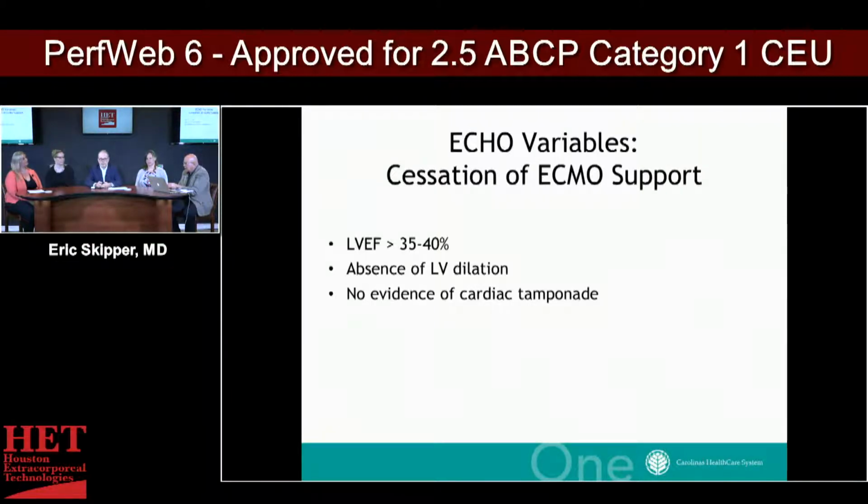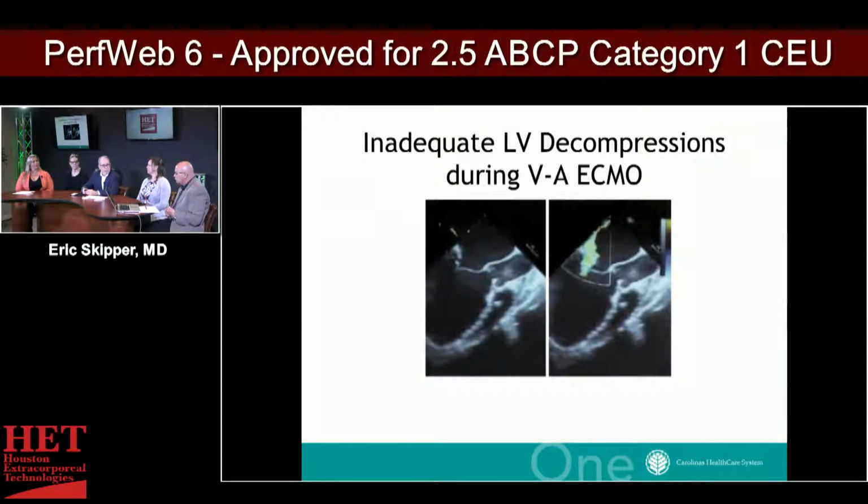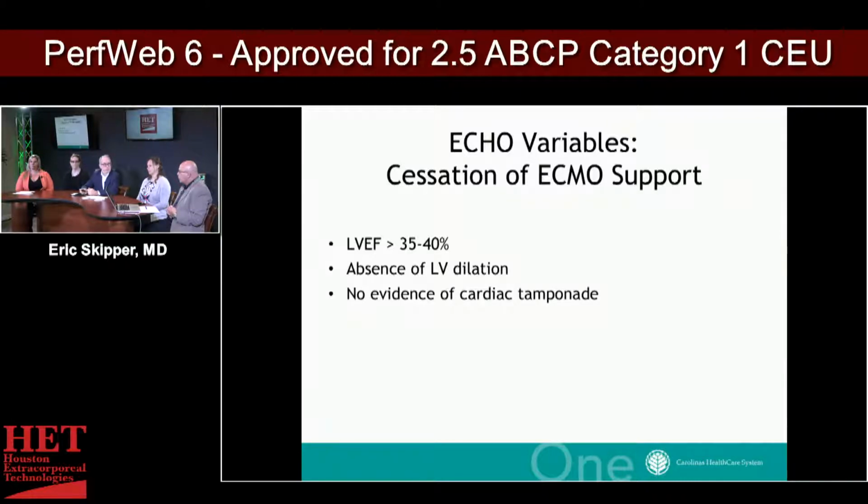So would you put an Impella in that? So I would do one of two things. If they were centrally cannulated, I would put a LV vent in. If I would consider an Impella, I would also consider a tandem type catheter across the interatrial septum. I think most people today tend to be favoring the Impella option, but it's certainly not an inexpensive option. And that's why I think if your chest is open and there's no reason not to, then going in and putting in a LV vent is not a problem. But you do need to do something, and I think that's your point.